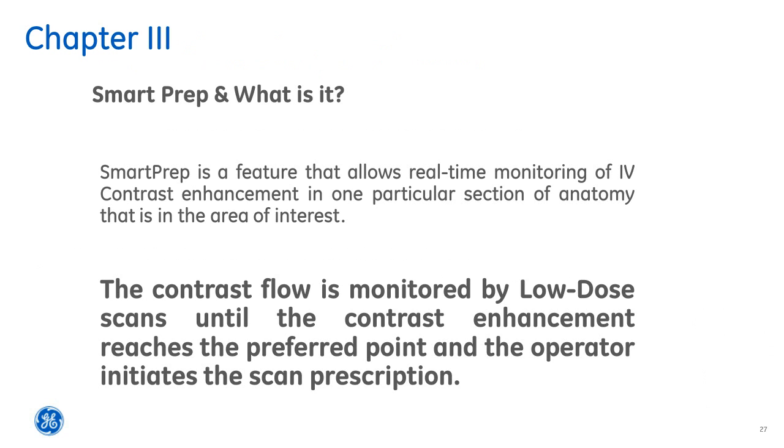So now we're going to have a look at Smart Prep and mirroring. In dedicated arterial examinations, we need to know that when we're going to trigger the scan, it's going to be when the contrast is at its optimum.